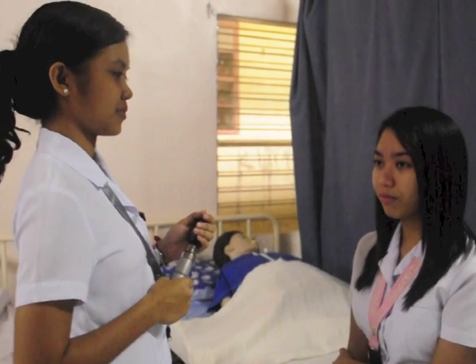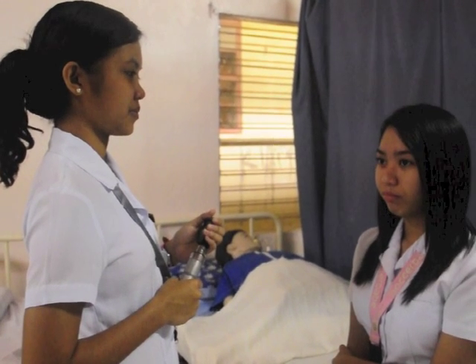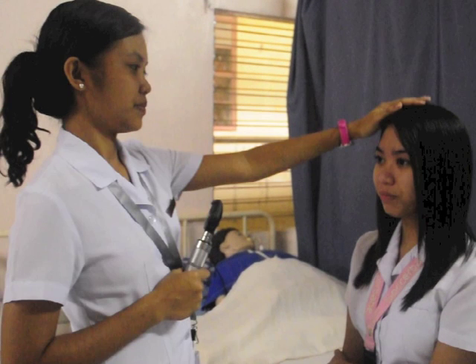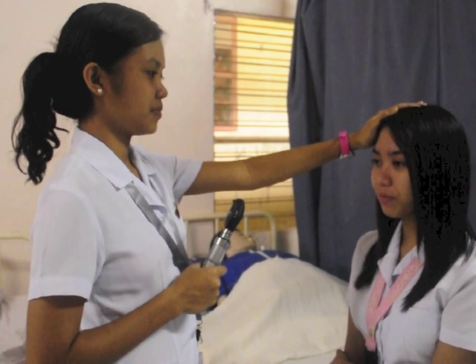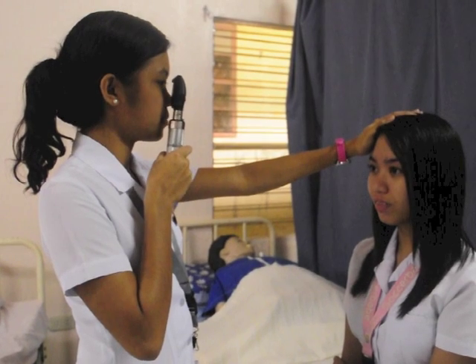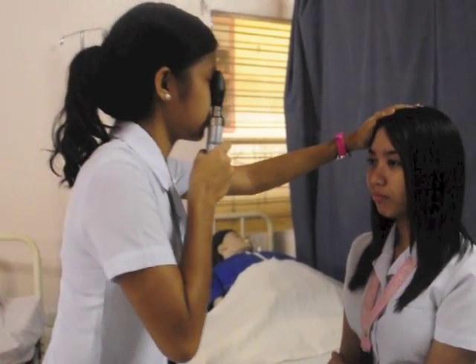Stand about 1 foot from the patient at a 15-degree angle from the patient's line of vision. Place index finger on the lens wheel and turn the wheel as needed to focus. Keep free hand on the patient's forehead to determine distance or closeness to the patient. Begin with the lens wheel at 0, shining light on the patient's pupil to identify the red light reflex.